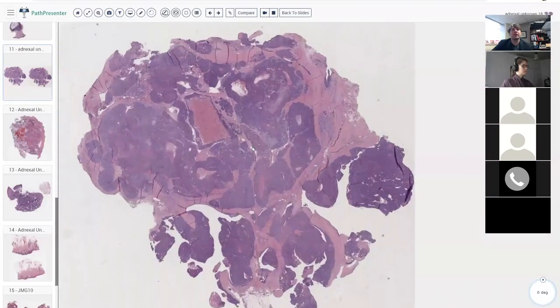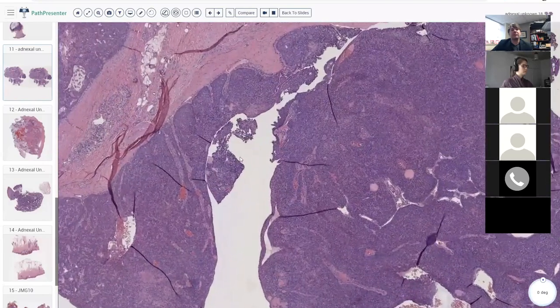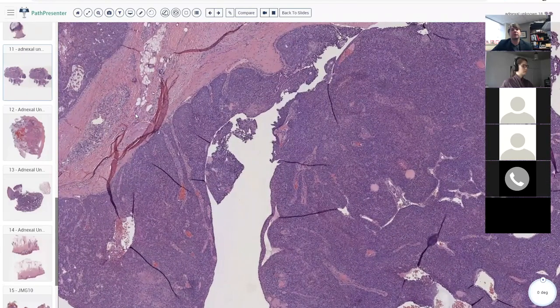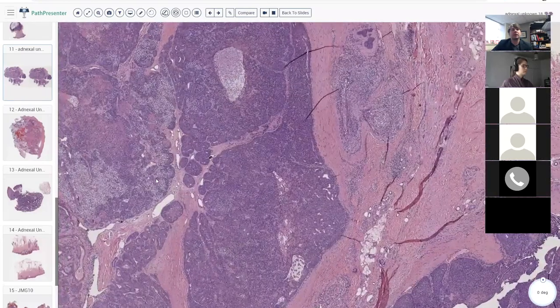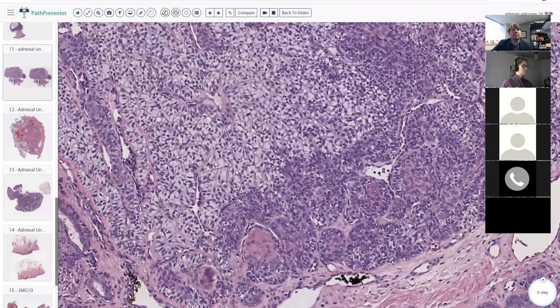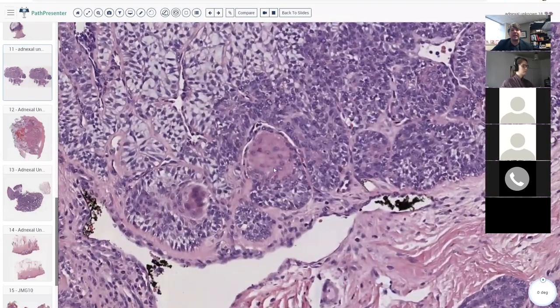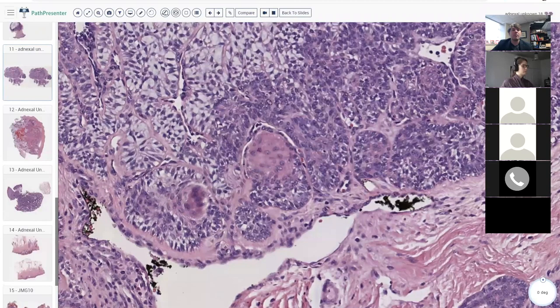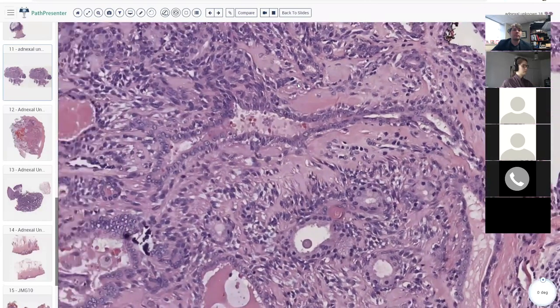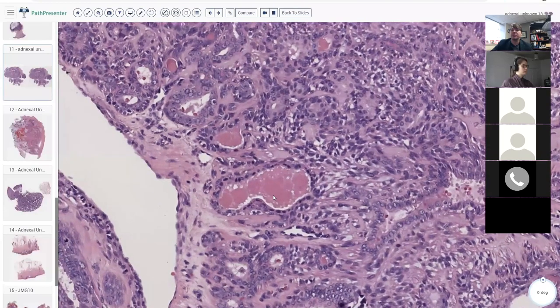Here we have sheets of cells, kind of multiple nodules, some mucinous background that makes it look almost clear, little tiny islands that look almost squamoid, some ducts lined by columnar or cuboidal cells, filled with some secretion.